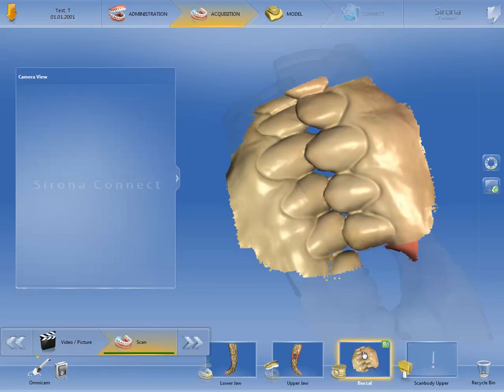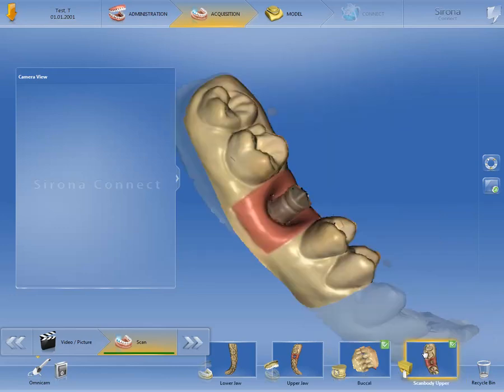Finally, we come to the image catalog Scan Body Upper. While the Sirona Connect software begins the model calculation in the background, you can insert the implant-specific scan body and complete the final scan. For this acquisition, ensure specifically that the scan post itself, as well as the transition from the gingiva to the scan post, have been captured properly and that there is no interruption. Otherwise, this may result in inaccuracies in terms of the position of the implant. It is often not possible to capture 100% of the bases or posts, but it should be possible to scan 2/3 of the surface area.